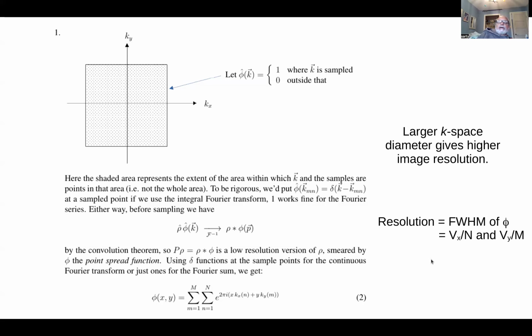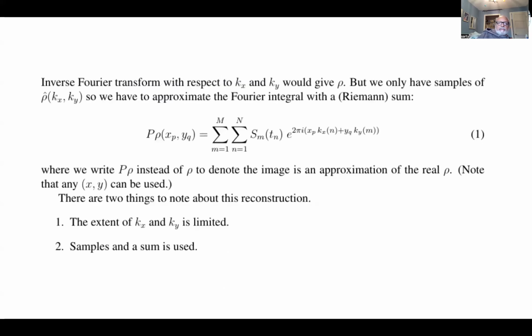Once you start messing with the reconstruction algorithms, you're never going to change that resolution. You might get images that have more pixels or things like that, but a lot of people call this the physical resolution of your image. This is all the information that you have, okay? So that's the resolution side of using this formula.